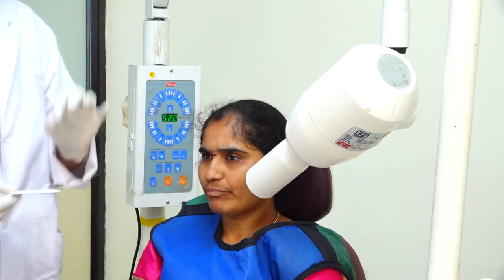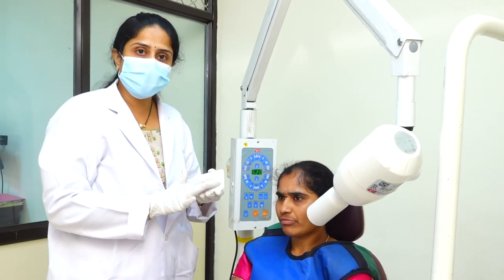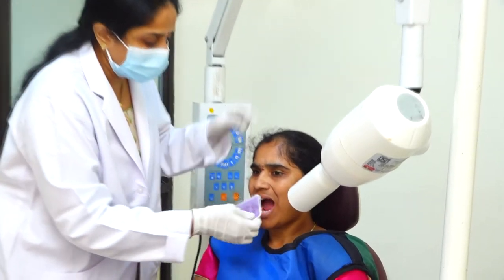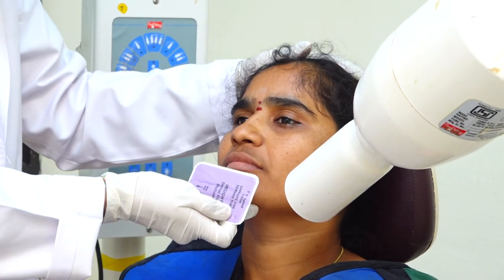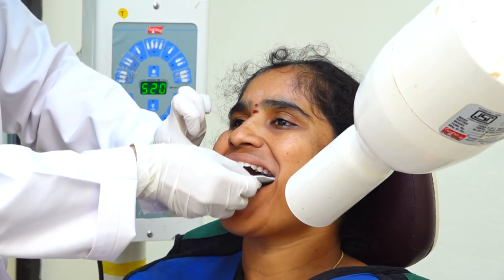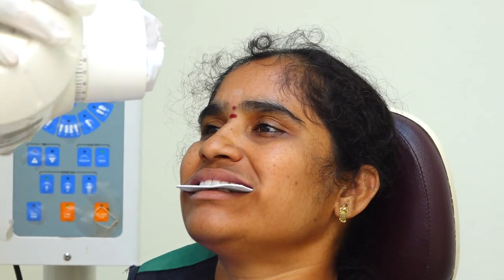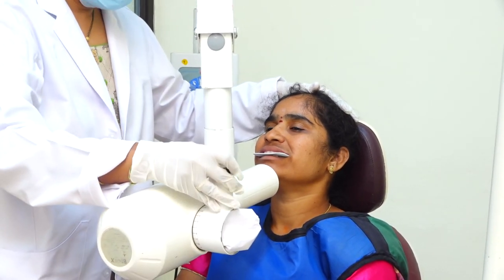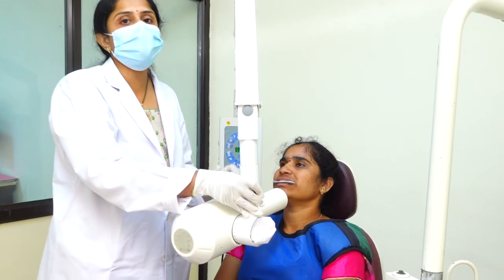Let's have a look at the mandibular occlusal radiographs. For the mandibular anterior radiograph, the white surface should be towards the tube side. The patient's occlusal plane should be at 45 degrees to the floor or horizontal plane, so the patient's head should be raised accordingly. Place the film inside the patient's oral cavity, ask the patient to bite, and adjust your angulation to minus 10 degrees. Expose the film through the tip of the chin. Note that the minus 10 degrees plus the 45-degree head tilt gives an overall angulation of minus 55 degrees.